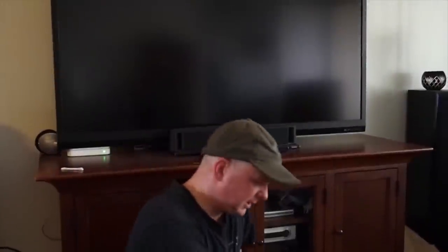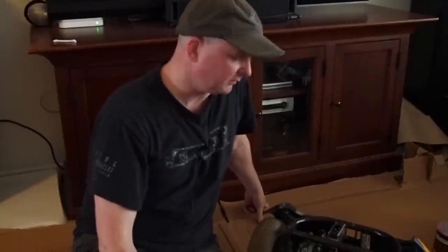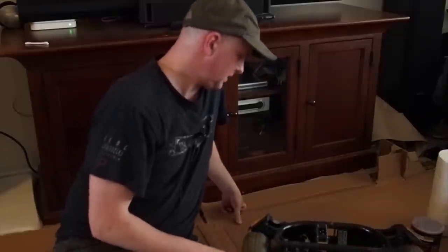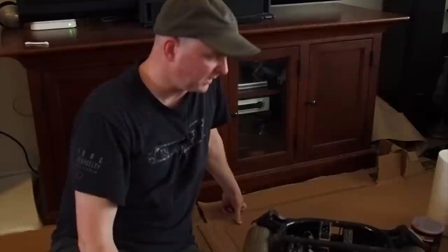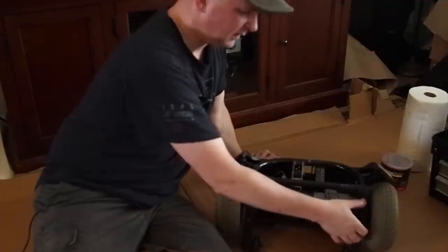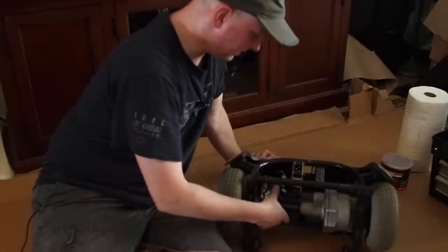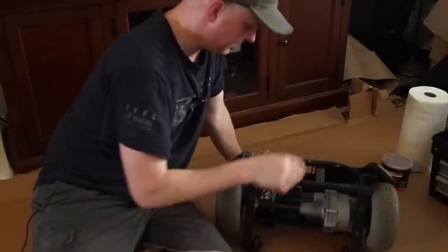All right, we're back. We're going to take apart this rear part of the mobility scooter. It is the GoGo Elite. It's not terribly complicated in terms of mechanical things. It's a pretty simple little contraption. There are these four big screws that hold the transaxle onto the frame, and this is it in terms of what's being held onto the frame.